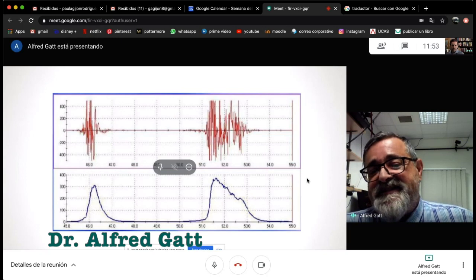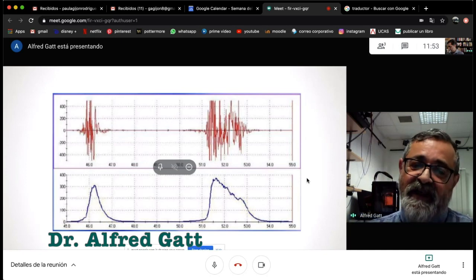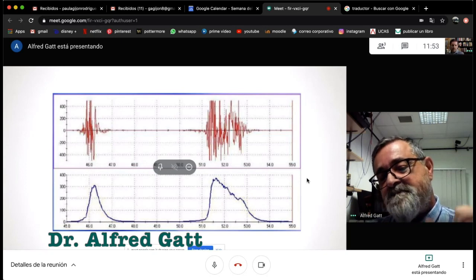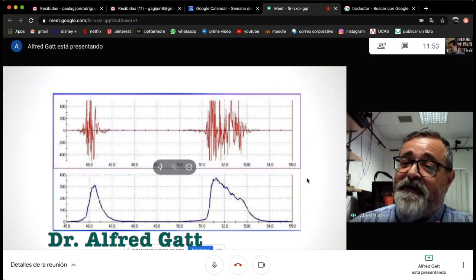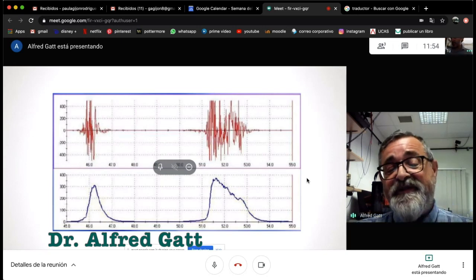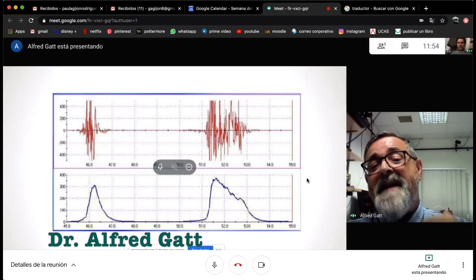So in these two signals here, we have two activation signals, and we can see that the timing of the first signal is much shorter than the timing of the second signal. Also, there was a period of no activation in between. So timing is very important to allow us to, for example, compare the activation of that muscle in relation to the gait cycle. Okay?